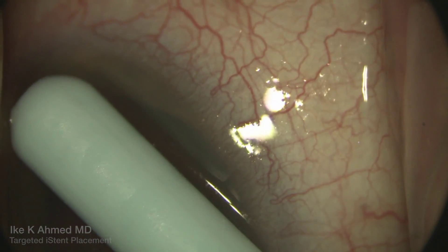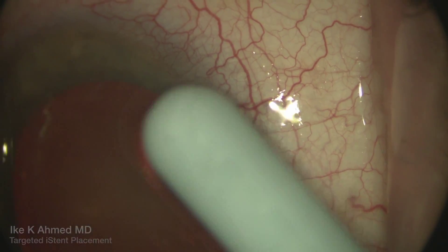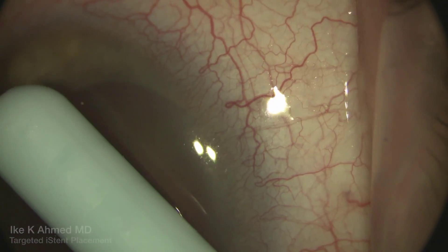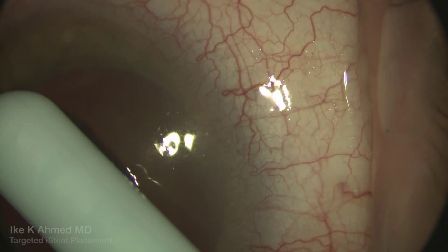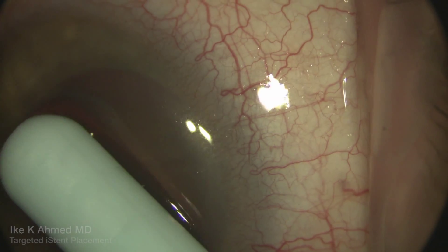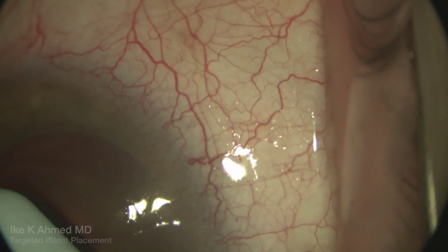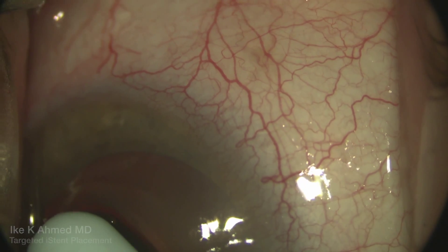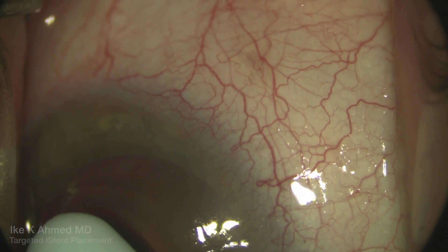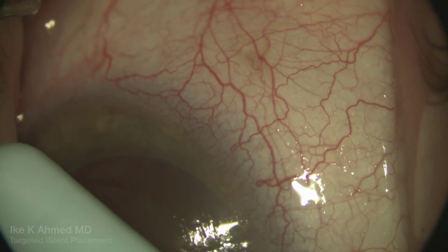With a bit of pressure on the cornea, increasing the pressure in the anterior chamber, we actually see some blanching of that tangential aqueous vein present emerging from the limbal area in the supranasal quadrant. You can see the laminar flow that exists with the pressurization of the cornea and the anterior chamber.